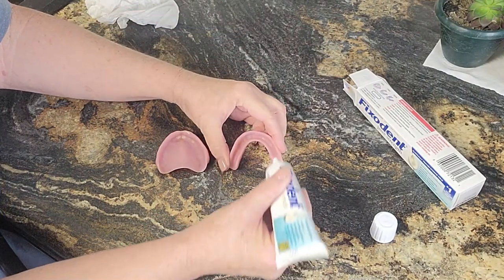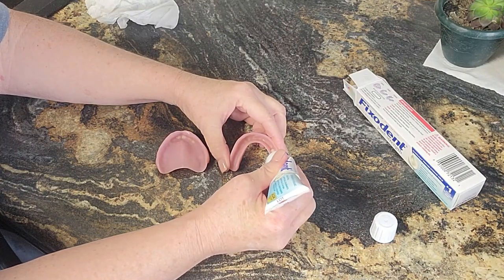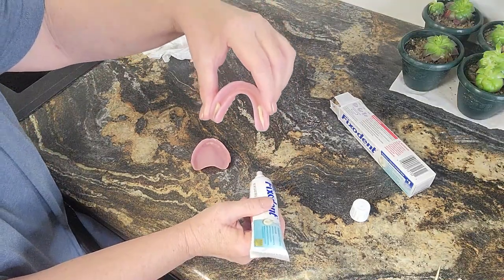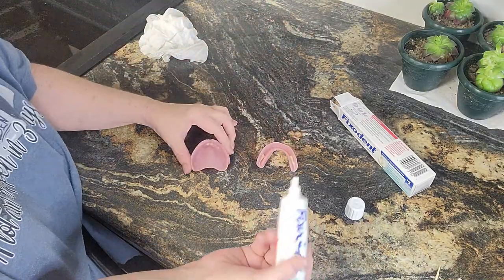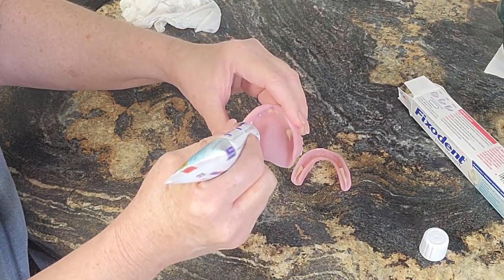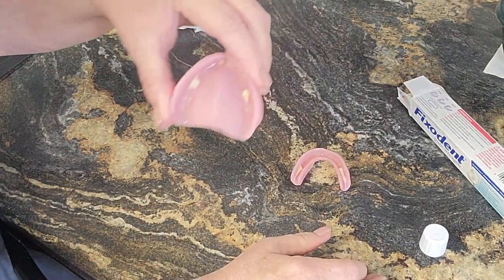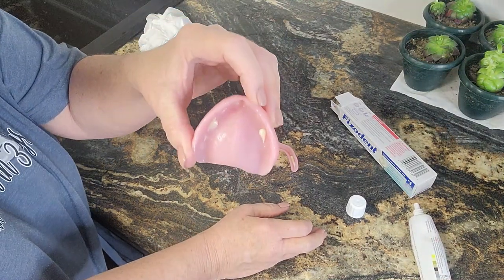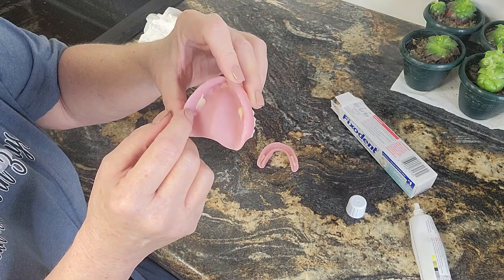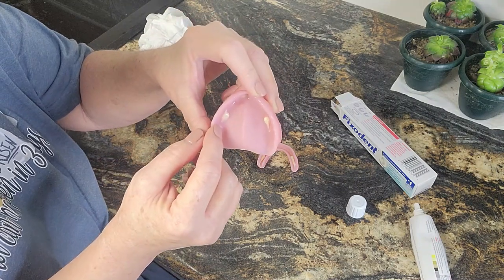Here's how I do it. I will take adhesive and only put a little here — that's probably too much — and a little here. Then I'm going to put a little dot here and a little dot here. That's all. Don't put this in your mouth like that because it's going to harden in your mouth into what is going to feel like a stone.